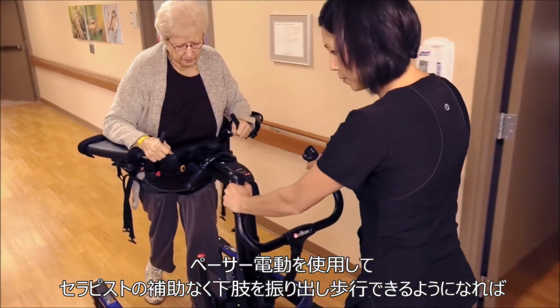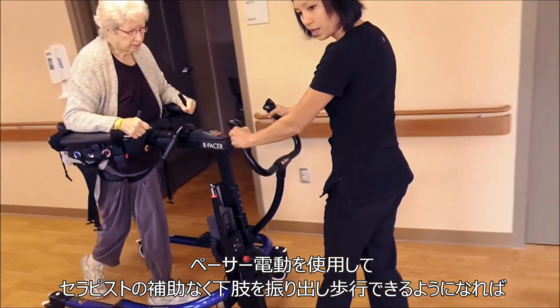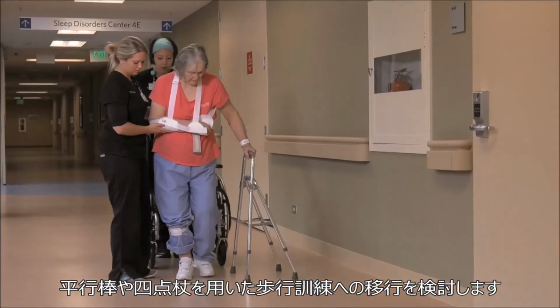Once a patient is able to ambulate easily in the Rifton e-Pacer, advancing her own weaker leg without assistance from the therapist or TheraBand, she may be ready to switch to gait at the HemiBar or with the Hemi Walker.